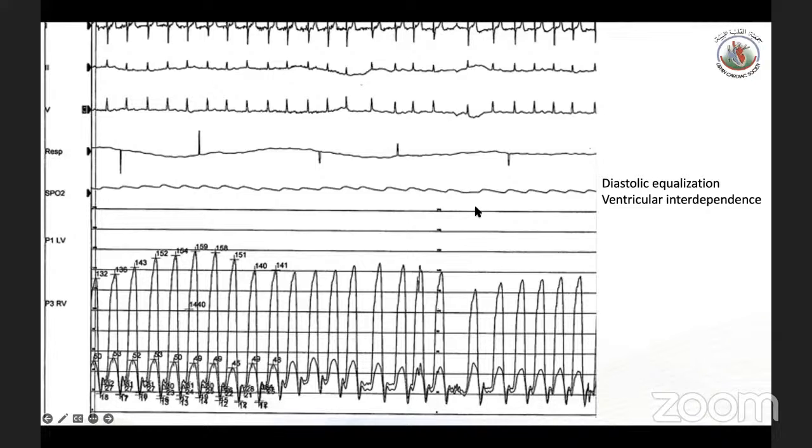In those cases, what I do usually, there's always, pretty much most of them, they come with heart failure. There's bilateral pleural effusions. So by the time you suck 1 liter of fluid from each side, and I always give inhaled Milrinone, I was always impressed by the response. By the time you finish the case, even before you go on pump, the PA pressure drops by 10-15 because you relieve the hypoxia and you actually give a pulmonary vasodilator, in the pulmonary circulation without impacting blood pressure.